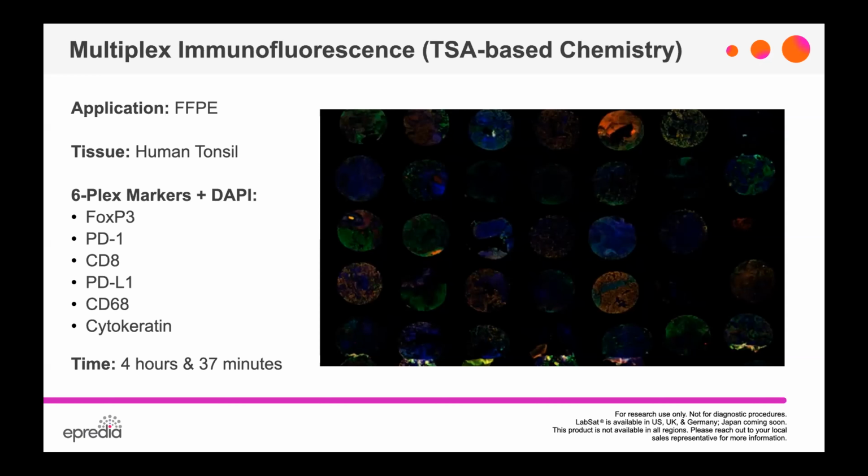And again, we did this with 100 cores for this particular application, so we could do a side-by-side comparison for our data coming out on the other side here. And the results are extremely good. We're able to get these nice patterns in here because of how the arrays are laid out, and then later go back in and do the quantification steps.